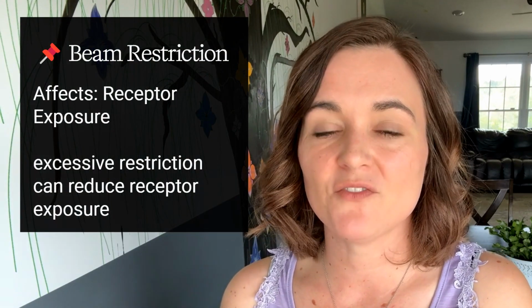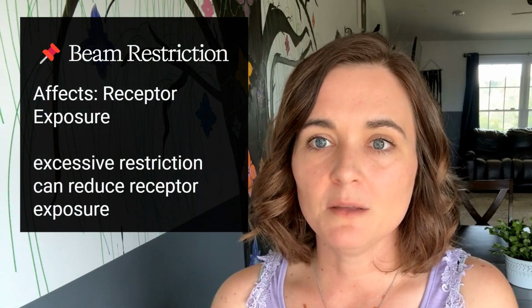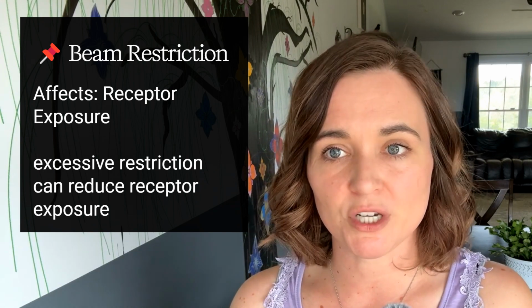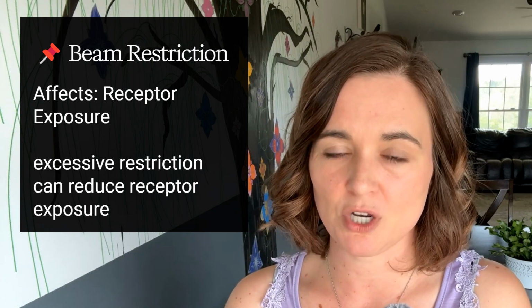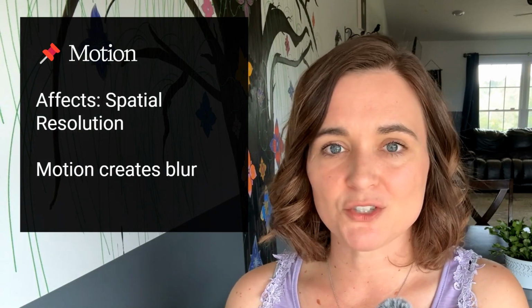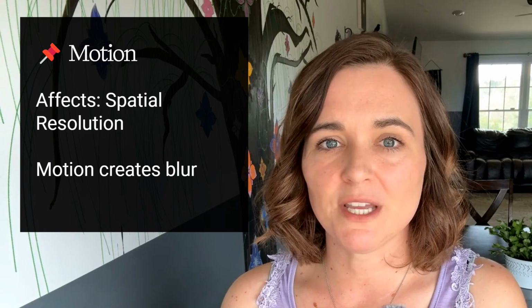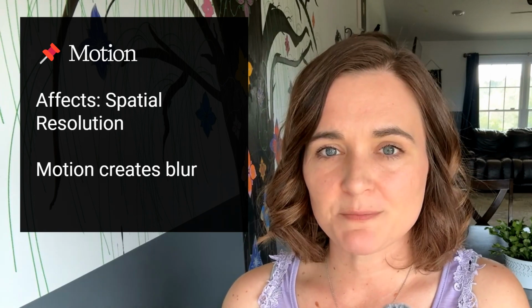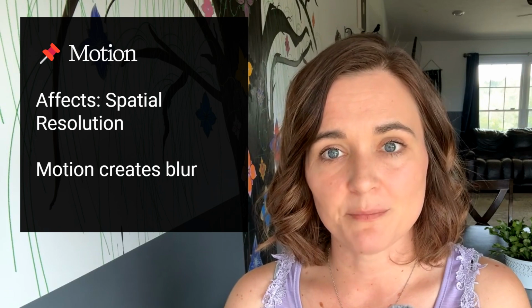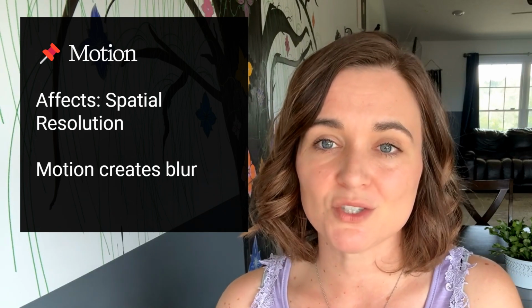Beam restriction. This affects your receptor exposure. Collimation reduces scatter and patient dose, but excessive restriction can reduce receptor exposure. Picture an open versus tightly collimated light field. Motion. This affects spatial resolution. Motion creates blur. Use short exposure times and immobilization to reduce it. Here's a tip. Patient education can be your best tool.